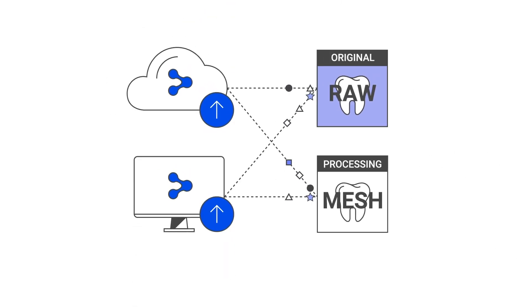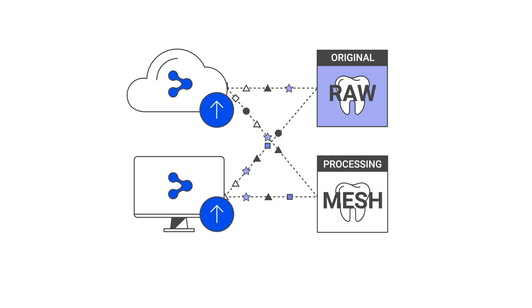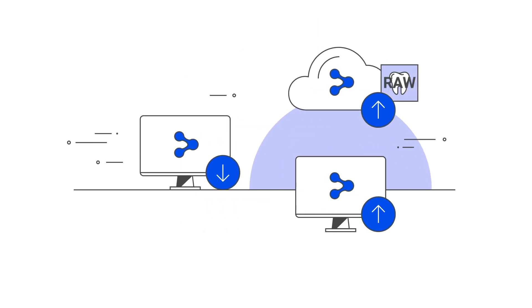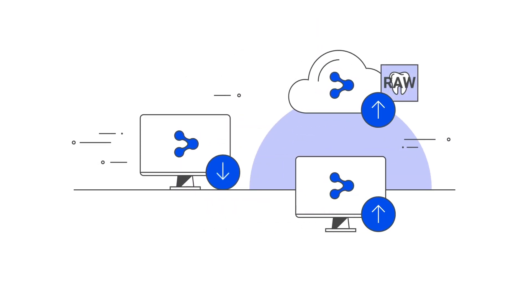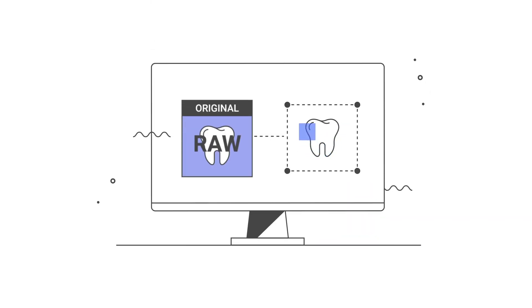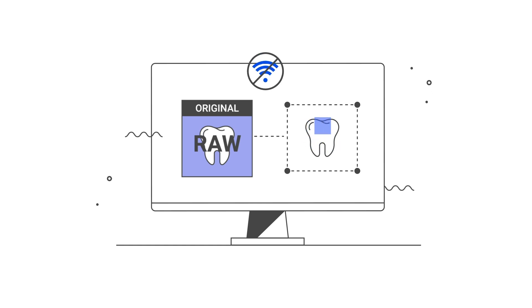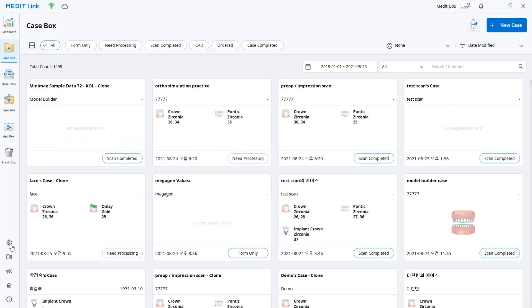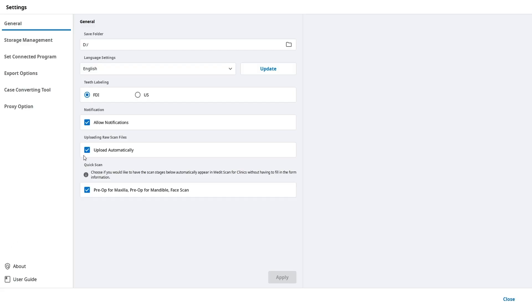Both the raw data and MeditMesh data are automatically saved to the cloud storage and your local PC. Raw data synchronized with the MeditLink cloud storage can be downloaded onto a different PC. Since it's the original scan data, you can perform additional scans and edit the scan data as you wish. If you have just one dedicated PC for scanning or if the local internet connection is poor, you can turn off the uploading raw scan files function in settings, and raw data will not be automatically saved to the cloud.